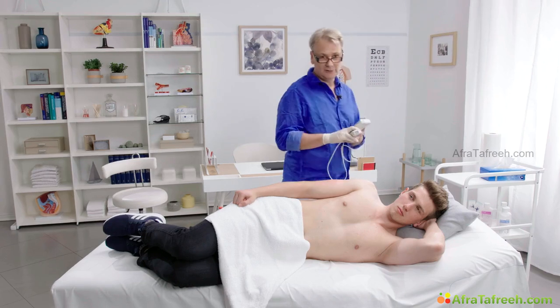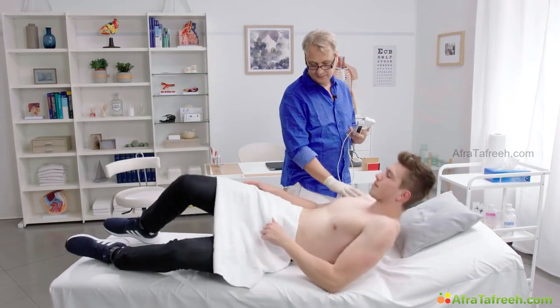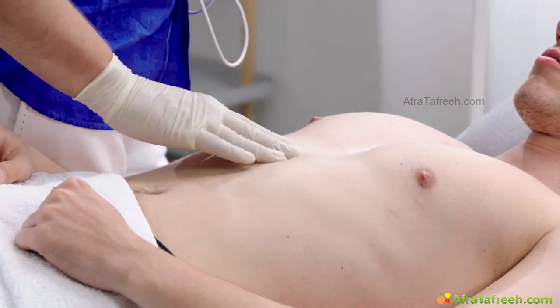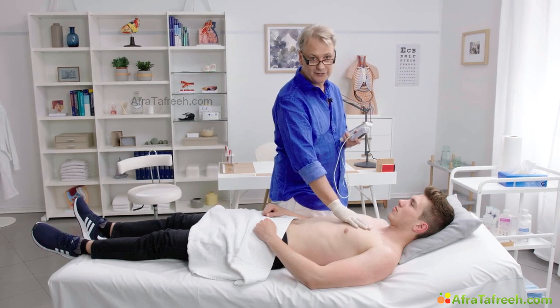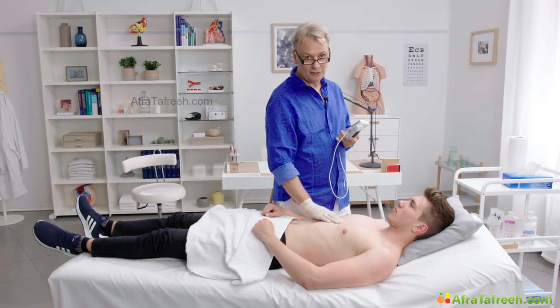The last imaging window I will show you is the subcostal window. To image from a subcostal position, you will have to position the patient on his back. Now, the heart is located right here. So when you image from underneath the xiphoid, you will have to image more towards the left. But remember, the heart is also positioned relatively ventral in the mediastinum, so you have to be relatively shallow.